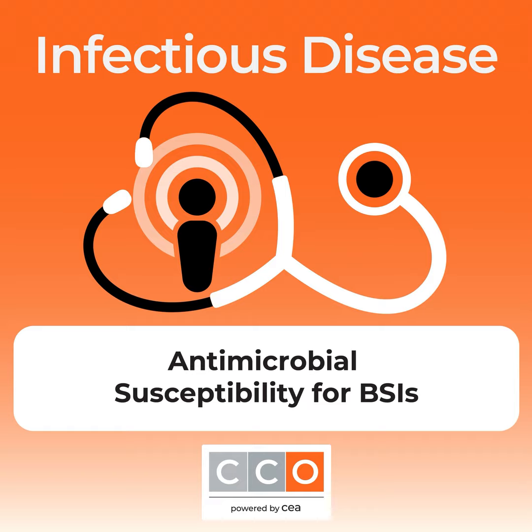Enterobacterales with no resistant gene detected. That's the best target for us. Rapid phenotypic AST can facilitate the de-escalation by providing susceptibility to basic penicillins with inhibitor, quinolones, and even trimethoprim-sulfamethoxazole for PO conversion as soon as possible.